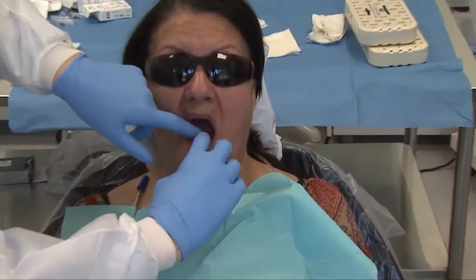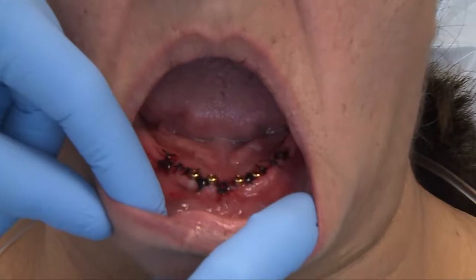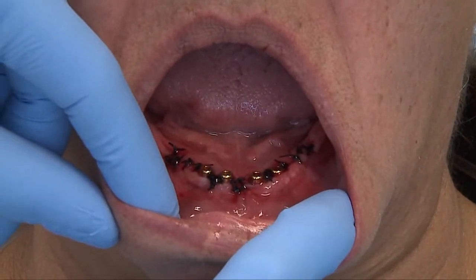Okay, and open. Alright. So here's our final implant positions — really nice, pretty ideal.